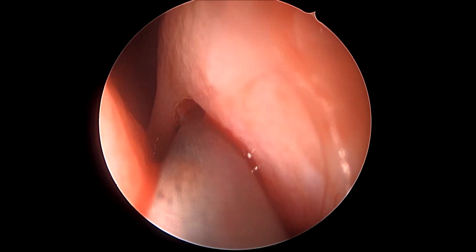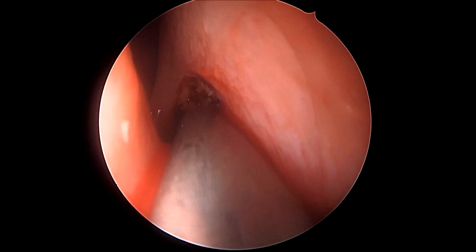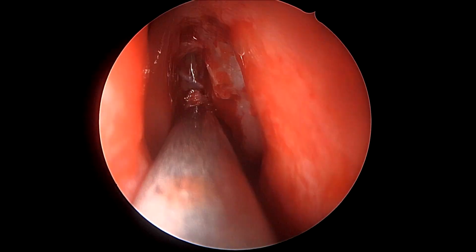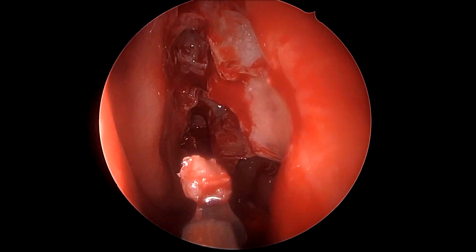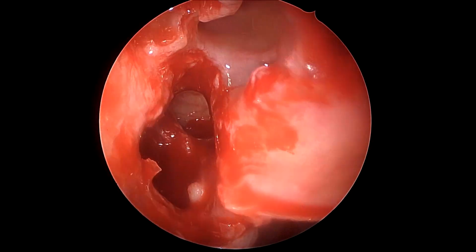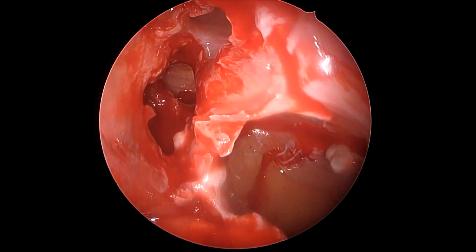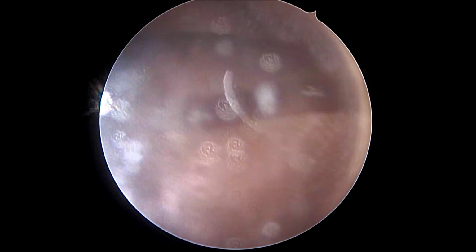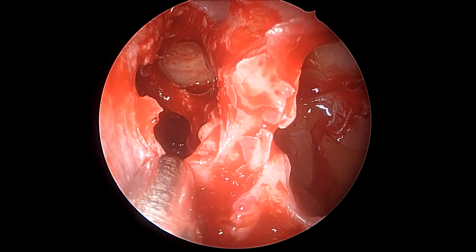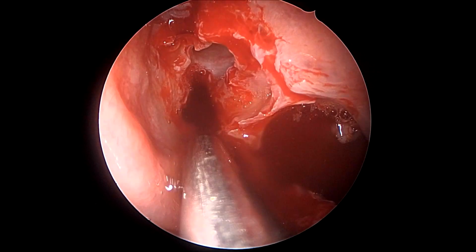Once again here, the same Hajek-Koffler punch is now used to increase our access towards the left-sided frontal recess by removing the anterior and the posterior walls of the agger nasi on the left side, so as to get a vision of the frontal recess on this side. As we can see, there are still some septations left, which will again need to be taken down to achieve a uniform and clear access of the entire ethmoidal skull base.